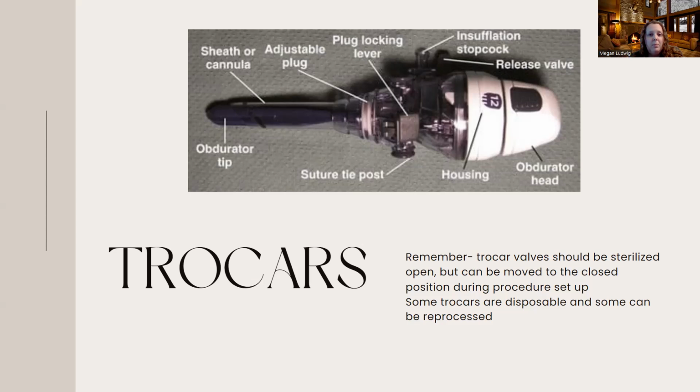So if you're placing one after we've put gas in the abdomen, gas doesn't escape out that tubing hole. Okay. Otherwise, it's just like popping a balloon, so to speak. So if it's closed, that gas cannot escape through that valve.